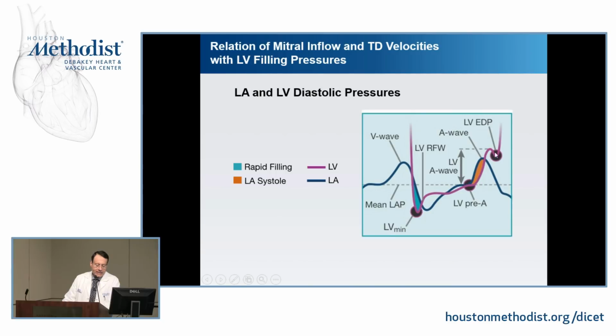So these are the diastolic pressures that you can measure in the ventricle. It is possible to get what we call a mean LV diastolic pressure. This is a temporal mean of all the pressures that are happening in diastole, and you measure them. Again, there are limited publications on the use of this mean LV diastolic pressure, but it has been done with high fidelity pressure catheters, not with fluid-filled transducers.